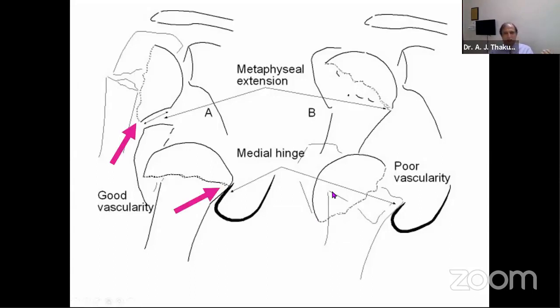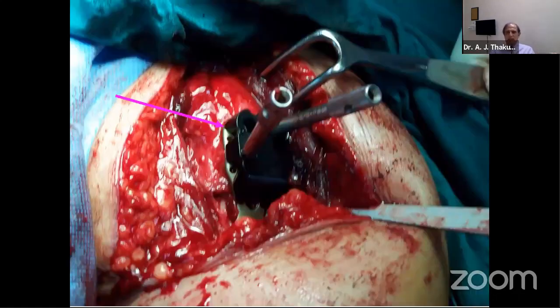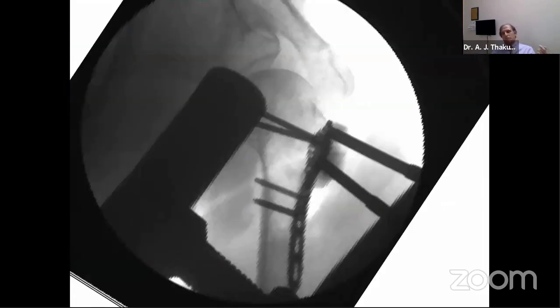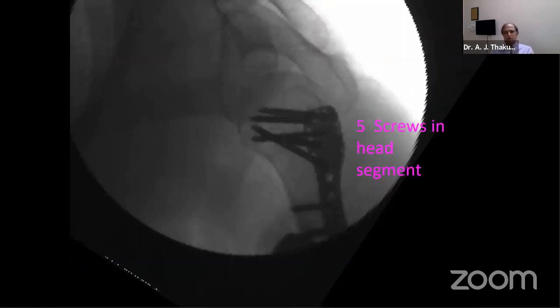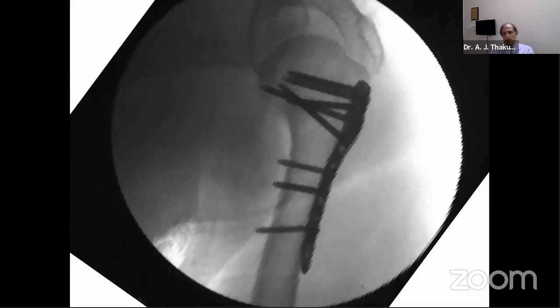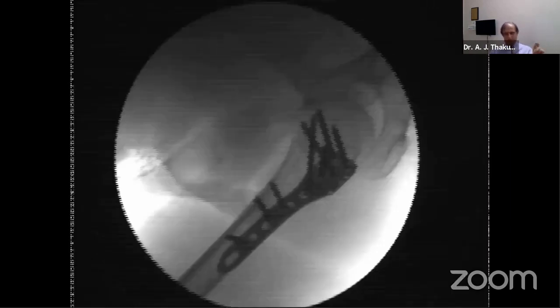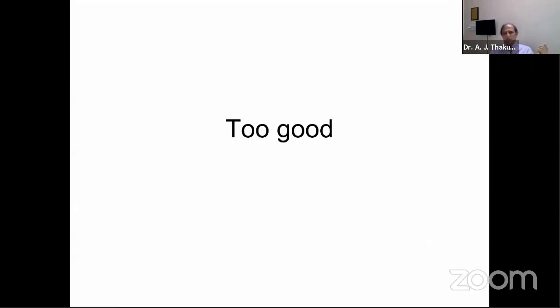This is quite well known, that we have this medial hinge. If there is a hinge here, something like this, then the blood supply continues. And if there is no hinge, something like this, then it will lead to a poor blood supply. I'm showing you another example in which a lady came up with this X-ray and she had a prompt surgery. Surgery went on very well, and it was held very securely. There was no problem whatsoever, and by the end of the second month she was getting extremely good results. She was very happy, and her happiness lasted for almost 7 or 8 months. Then she started getting some kind of discomfort.